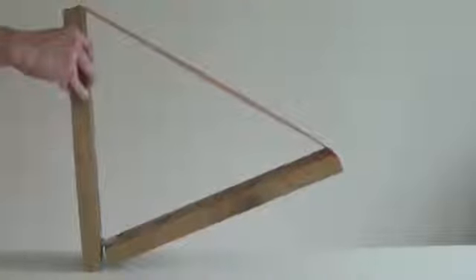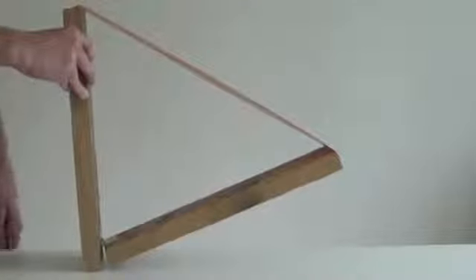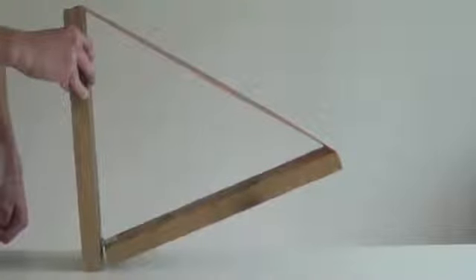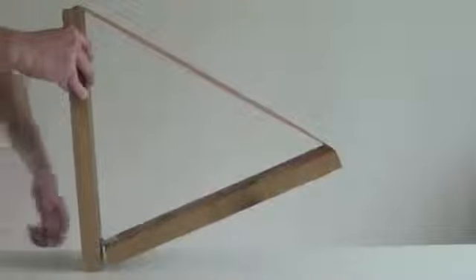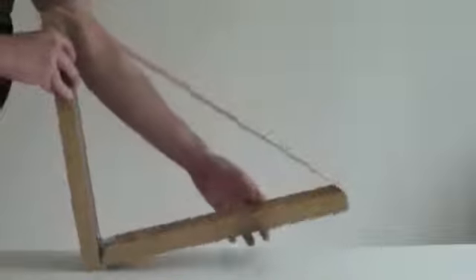That's why with the dynamic taping techniques, most of the time we are applying it with the tape in that short position so that we can make use of that mechanical advantage.